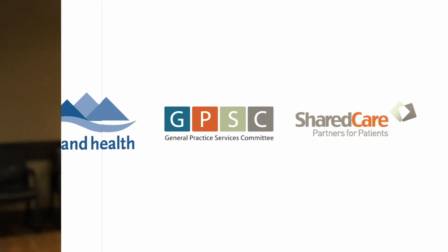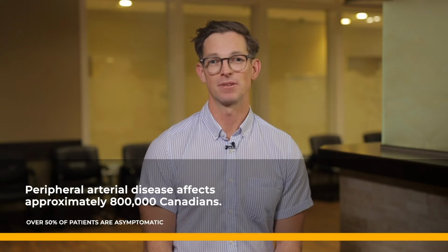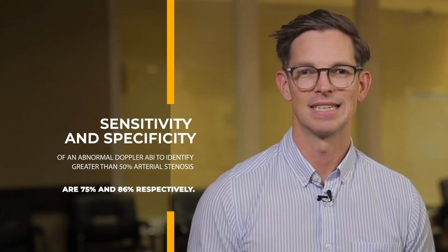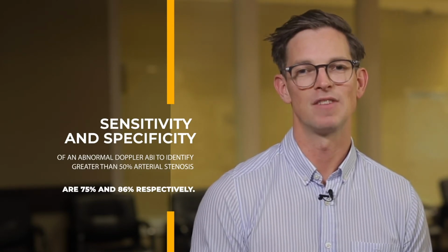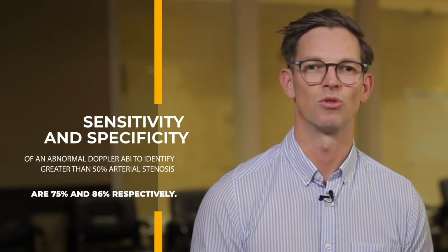So, why should we assess ABIs? Peripheral arterial disease affects approximately 800,000 Canadians. Over 50% of these patients are asymptomatic, which is important as research demonstrates that patients who are asymptomatic with an abnormal ABI have poorer cardiovascular disease outcomes than patients with normal ABIs. Most recent meta-analyses show that the sensitivity and specificity of an abnormal Doppler ABI to identify greater than 50% arterial stenosis are 75% and 86% respectively.